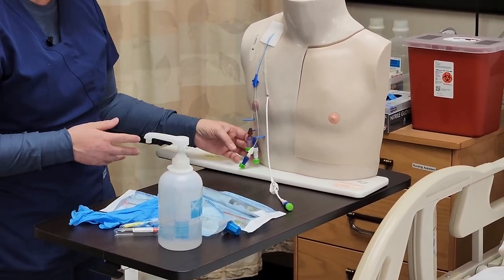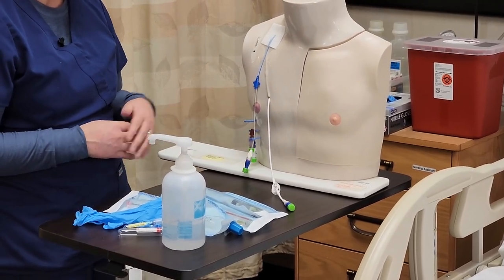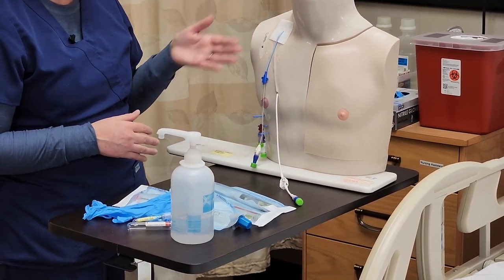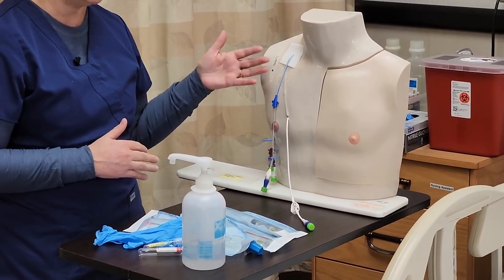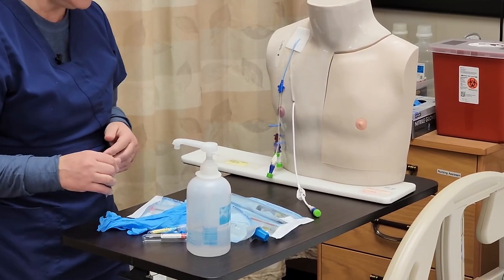As you can see, all ports have disinfectant caps on, so I'll have to remove that before I take my blood sample. I'm also assessing the site of the catheter to make sure that it is intact and there isn't anything abnormal with the site, and I'll make sure to document at the end as well.